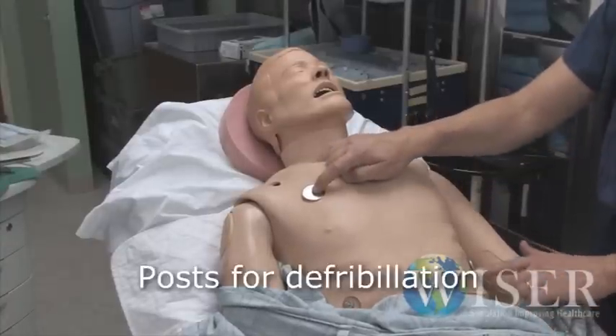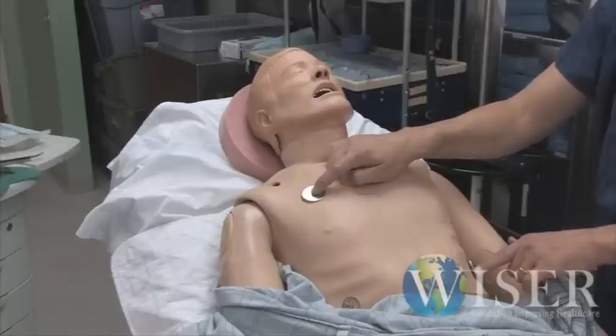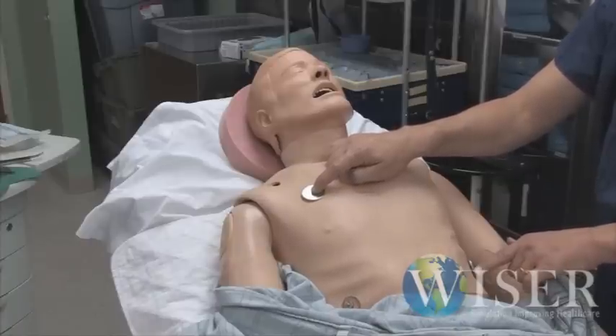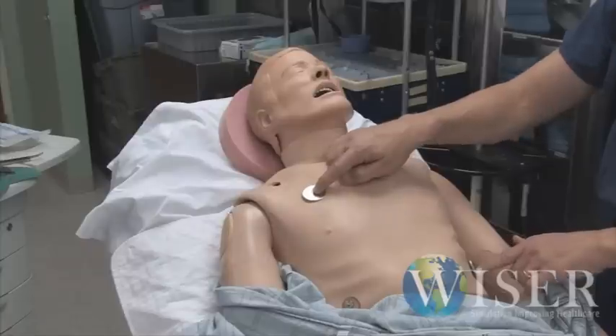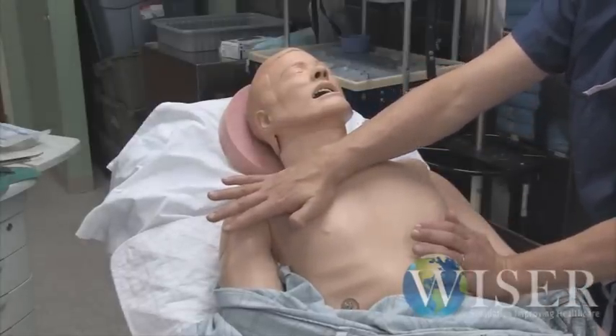These posts are for defibrillation. We use a live defibrillator. So number one, obviously be careful with it because you could hurt yourself or somebody else. And number two, if you need to defibrillate the patient, be sure and put the pads here on these posts and that will dissipate the charge.